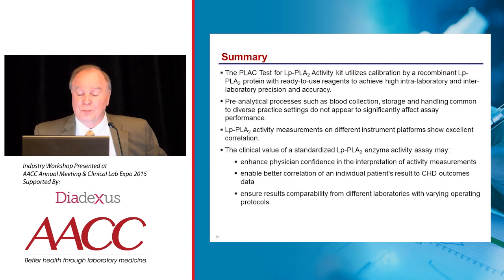The pre-analytical processes that we usually worry about, with storage of samples, for example, do not appear to be significant. Of course, we have to do more studies, but so far that's looking quite good. It looks like we can measure this activity on virtually any automated instrument, or at least the 13 that we've looked at so far.